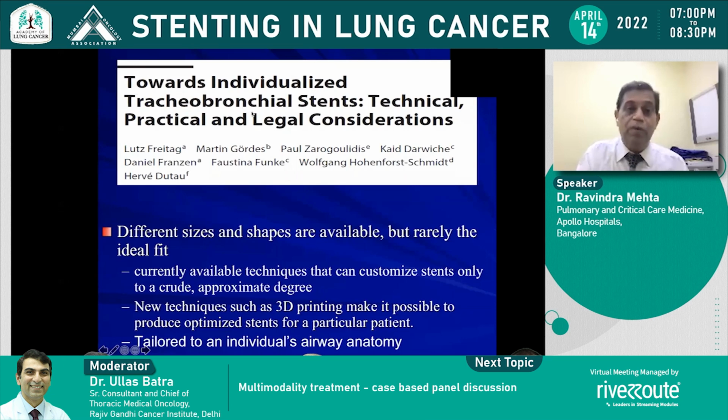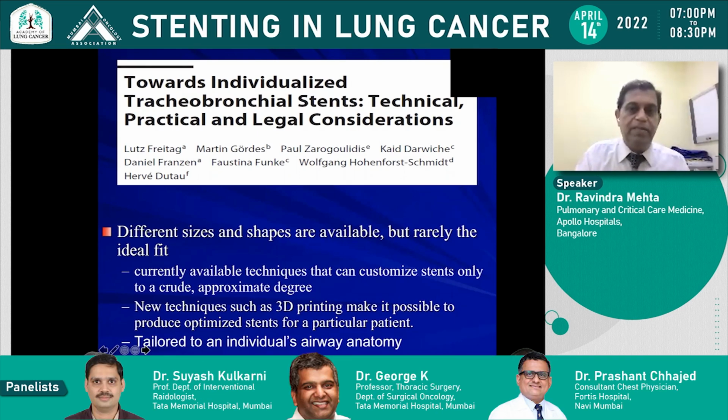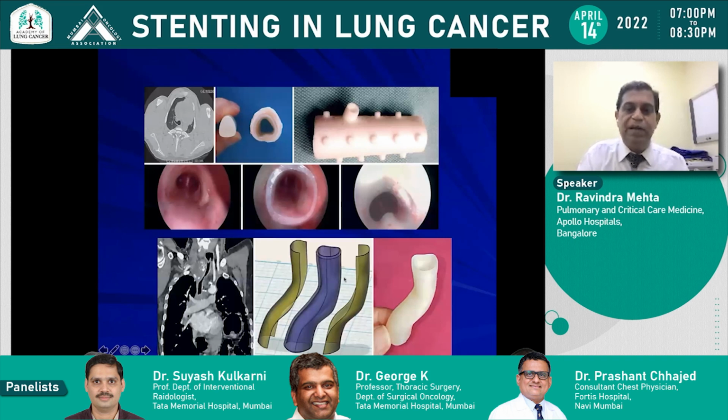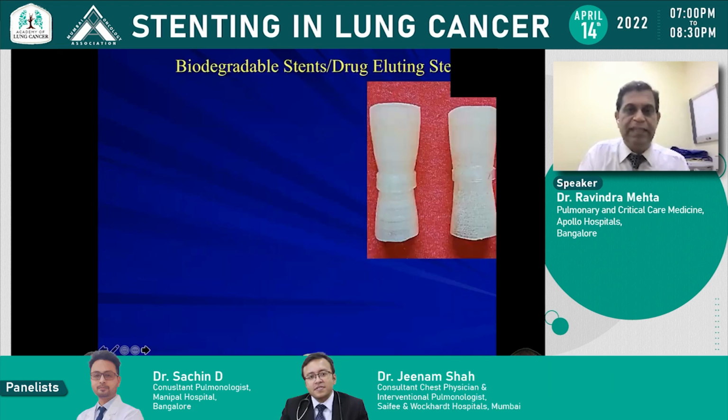New things out there: well, customization. Why not customize these stents? I don't have time for details, but 3D printing is coming in stentology so as to make things better. You can see these pretty pictures, which are trying to make sure these weirdly shaped lesions with compression can be somehow compensated by preparing good 3D printed stents.